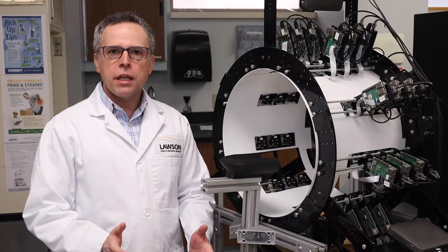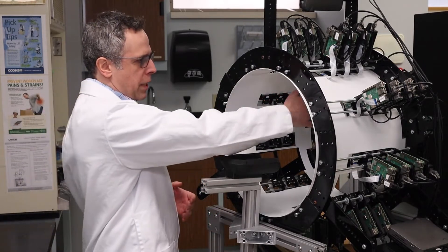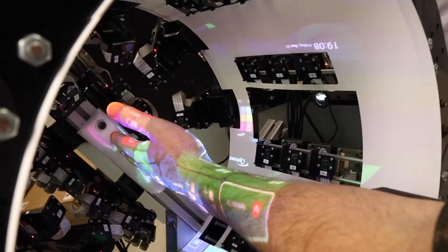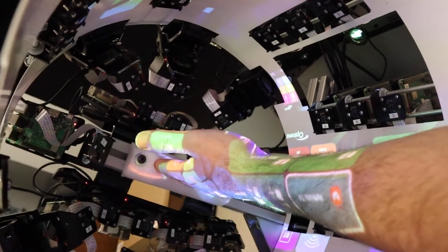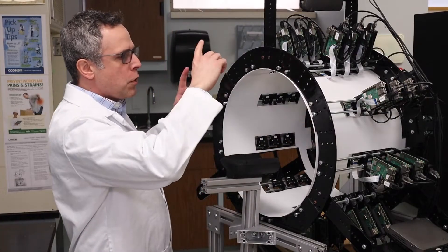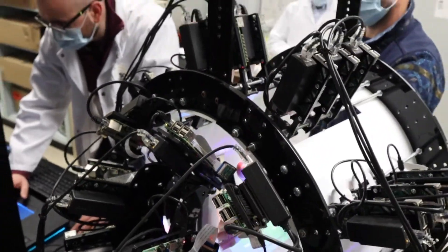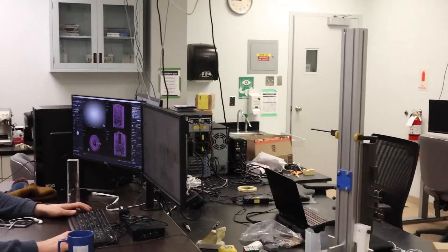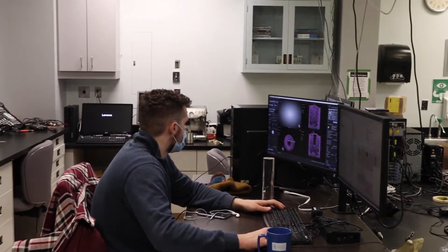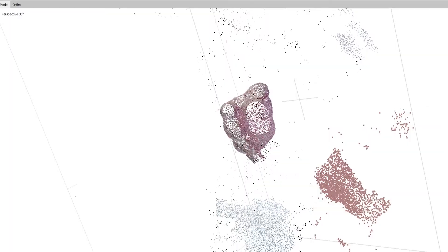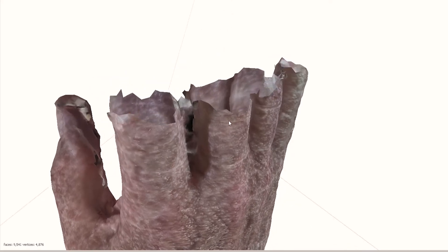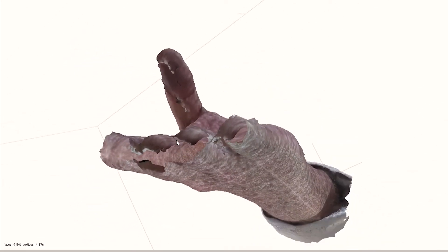The process begins with this 3D scanner. We ask the patient to place their arm inside the scanner like this, and the 42 cameras around the scanner take instant snapshots of the patient's arm. From that, we use a process called photogrammetry, which stitches together all those 42 images into a three-dimensional model of the patient's arm.